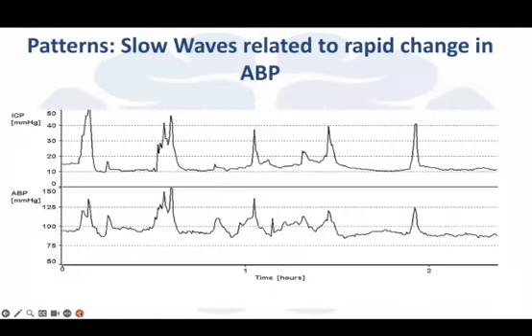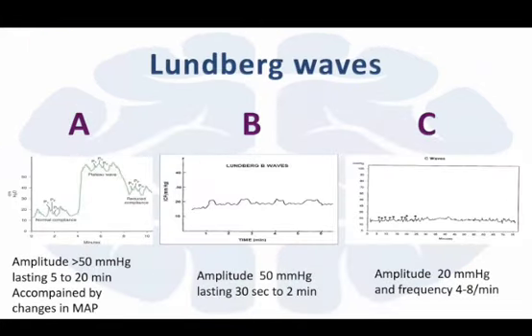But between this very bad situation and the stable ICP, we have different shades of gray that it's important that we learn to assess. For example, this is a typical case of a patient who has a high number of slow waves. What are the waves of intracranial pressure? You have to look at the trend and detect whether you can see this, because these reflect as well the intracerebral compliance and the intracerebral physiology.